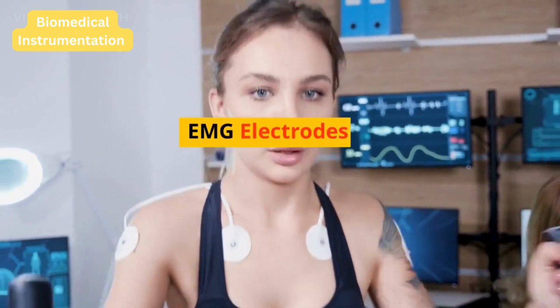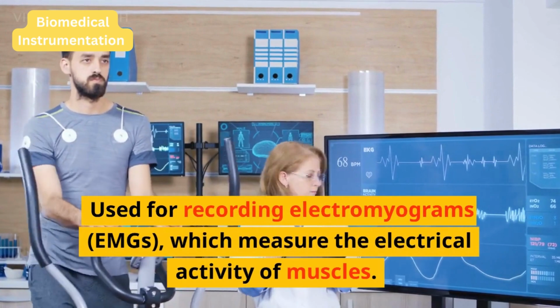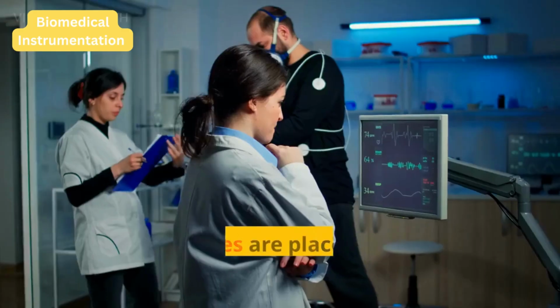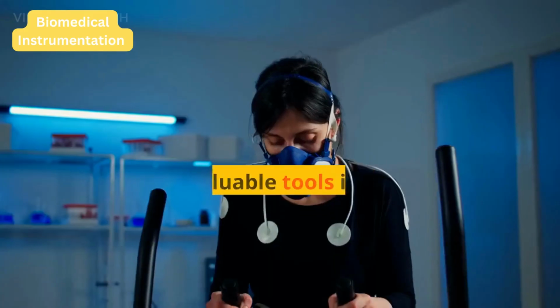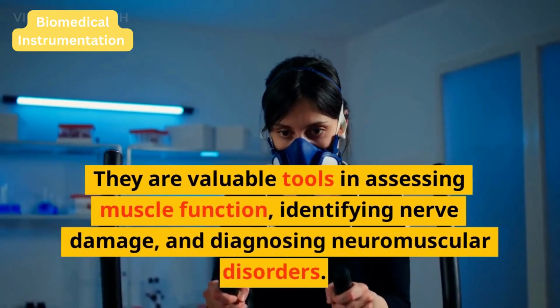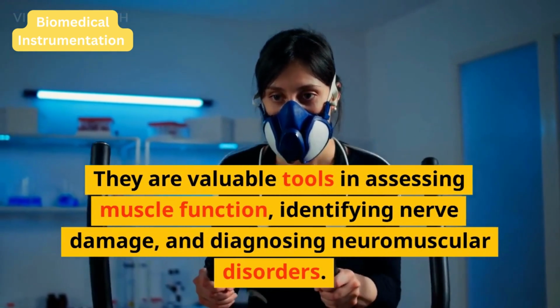EMG electrodes. Used for recording electromyograms, EMGs, which measure the electrical activity of muscles. EMG electrodes are placed on the skin above the muscle being examined. They are valuable tools in assessing muscle function, identifying nerve damage, and diagnosing neuromuscular disorders.